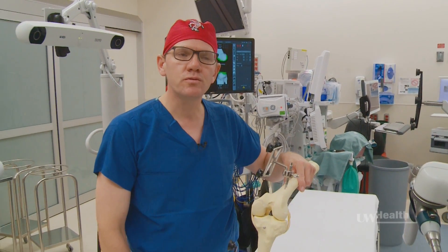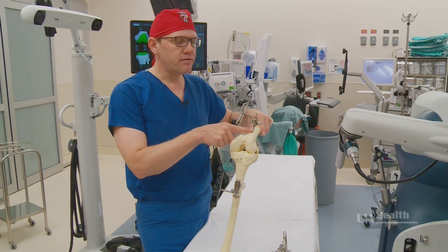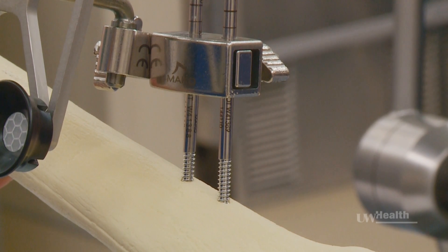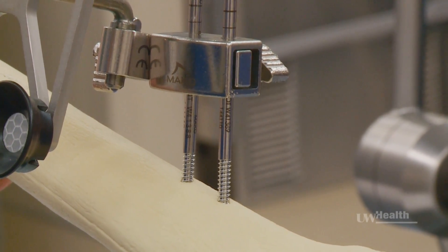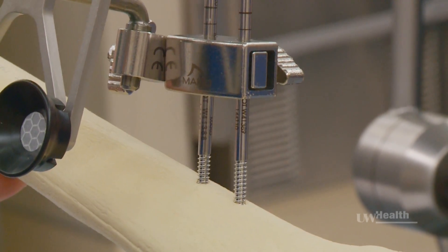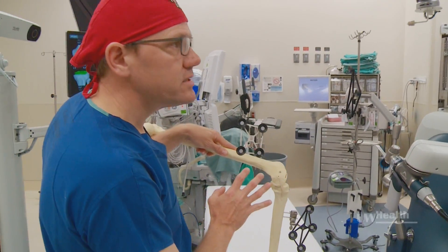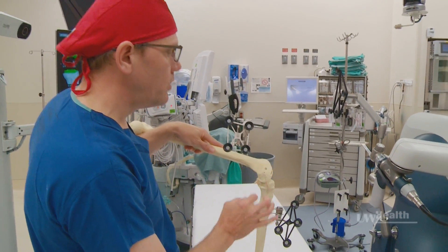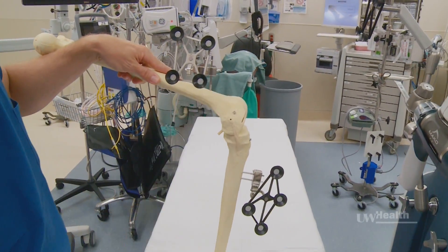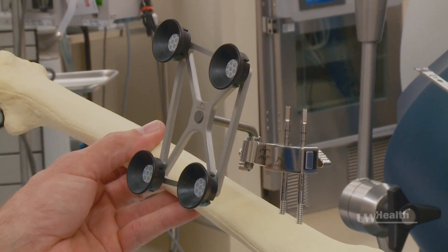Patients will have two small poke holes above their knee incision and below their knee incision. The reason for that is so that these arrays can be present such that we can register the patient and tell this computer where that person is in space.